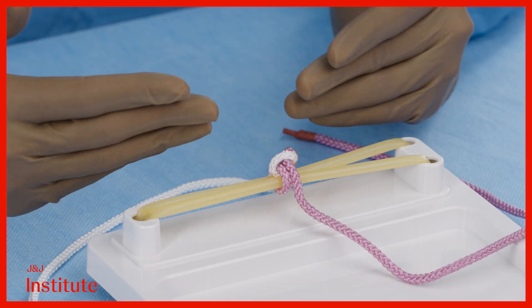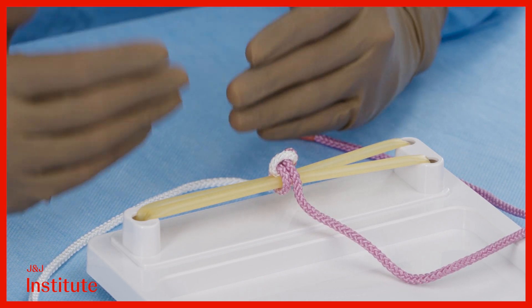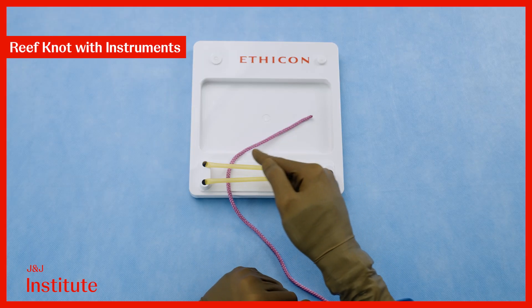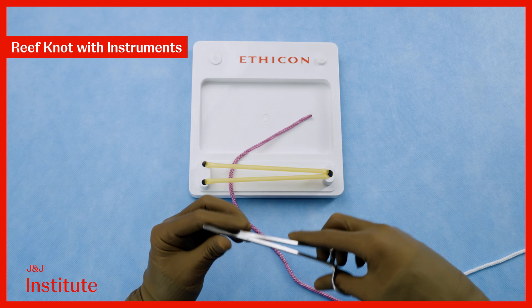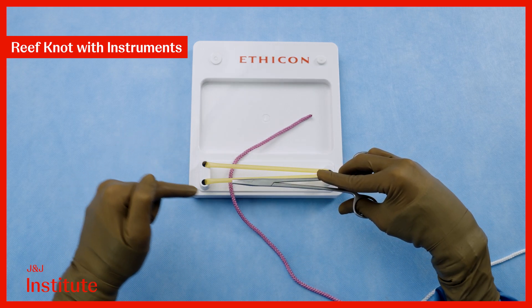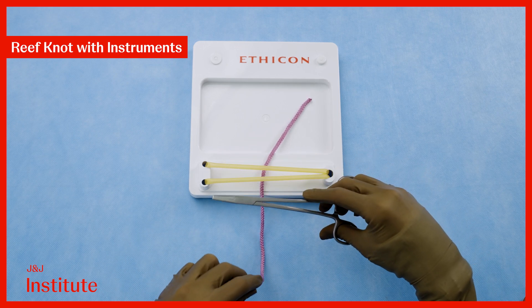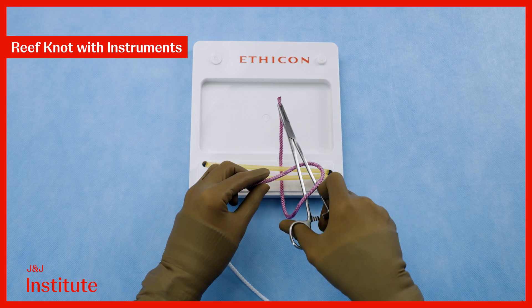Having seen how to create reef knots with left-handed knotting, I'll now be demonstrating how to do the same with instruments. After passing the suture through tissues, position the needle driver parallel to the incision within the V that is created by the two ends of the suture. Loop the long end of the suture around the needle driver, then reach over and grasp the short end.